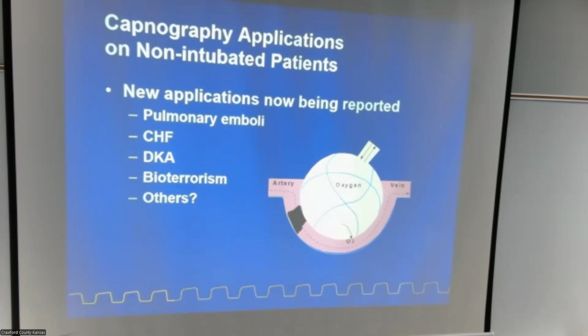Non-intubated patient. So we're going to be looking at pulmonary emboli, congestive heart failure, DKA, bioterrorism, and maybe some others here. We can go through them.